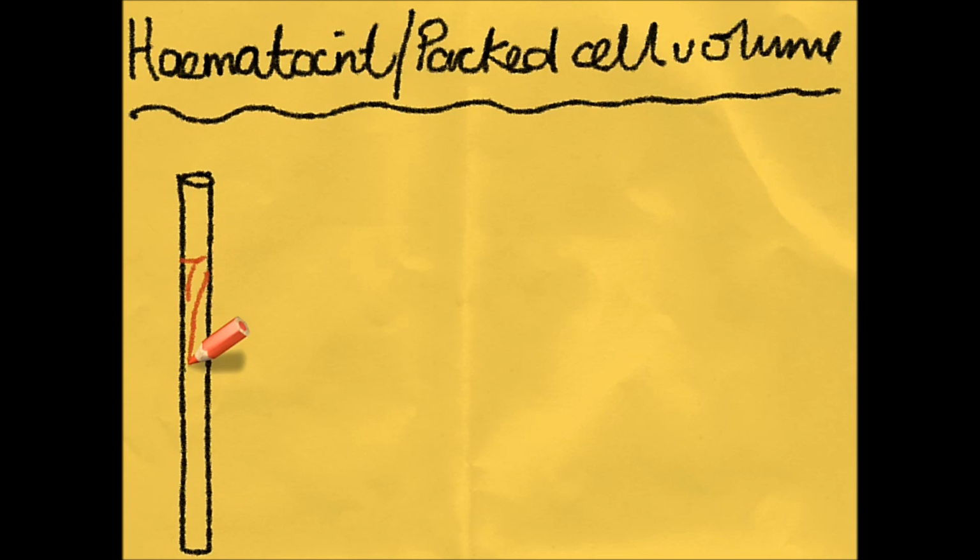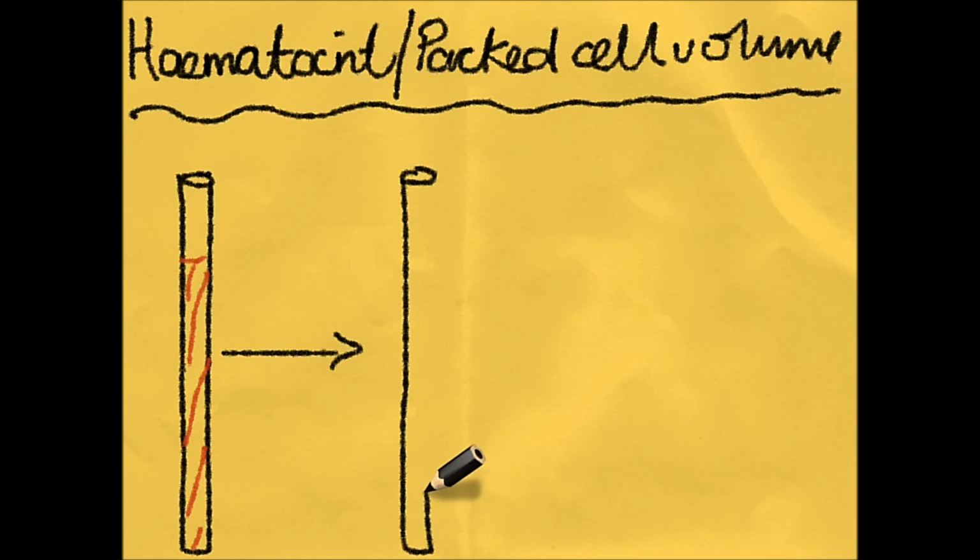The hematocrit, or packed cell volume, these terms are used interchangeably. And to explain what these mean, I'll explain to you how the parameters were derived manually. Essentially what used to happen was that we would take a column of blood into a capillary tube of known bore size.